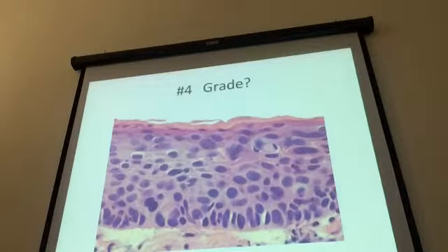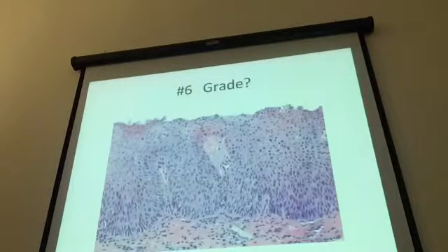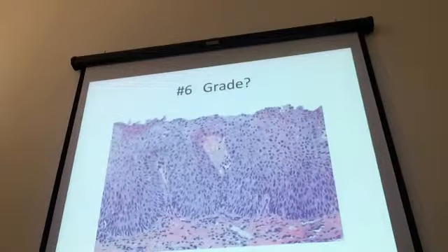Moderate. Say moderate. How about this one? Low grade. Parakeratosis, dyskeratosis. Low grade. And how about this one? High grade. Okay, so I'm very proud of you. You all identified the high grades correctly.